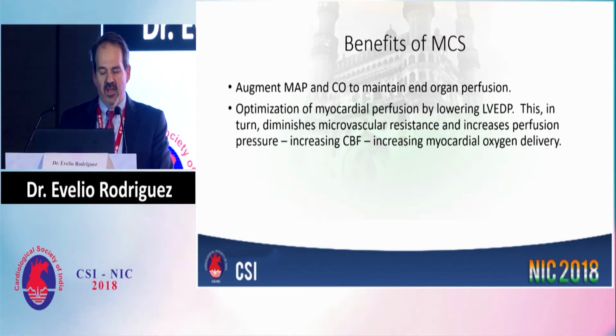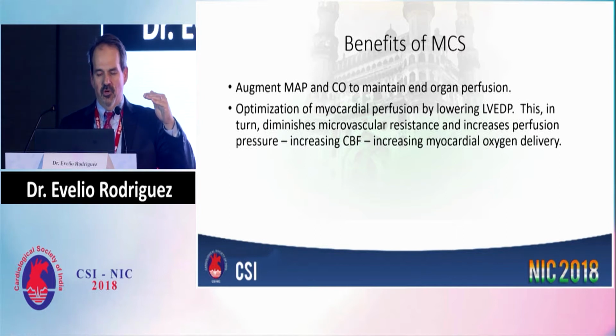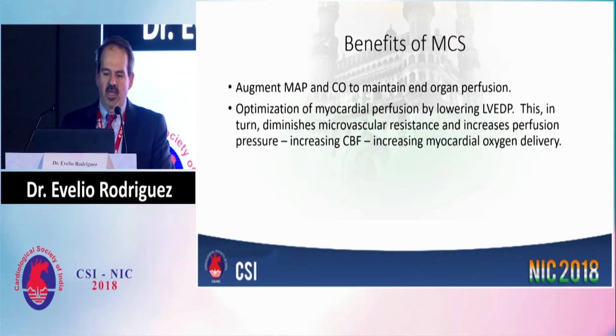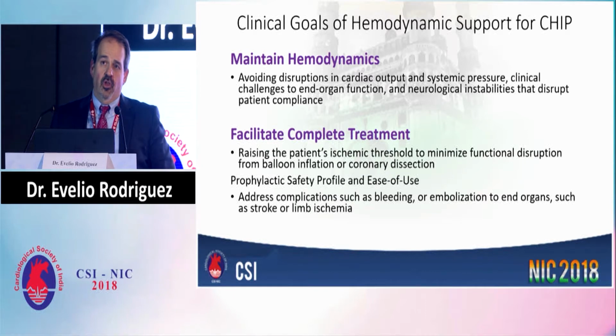What are the benefits of mechanical support? Basically, you are augmenting mean arterial pressure. In the case shown yesterday by Dr. Colombo, you saw that during balloon occlusion the pressure went down, but it was maintained. You also maintain end-organ perfusion, such as kidney perfusion, and you are optimizing myocardial perfusion by lowering the end-diastolic pressures, especially if you're using a device that unloads the left ventricle. And by unloading the left ventricle, you're minimizing the oxygen demand.